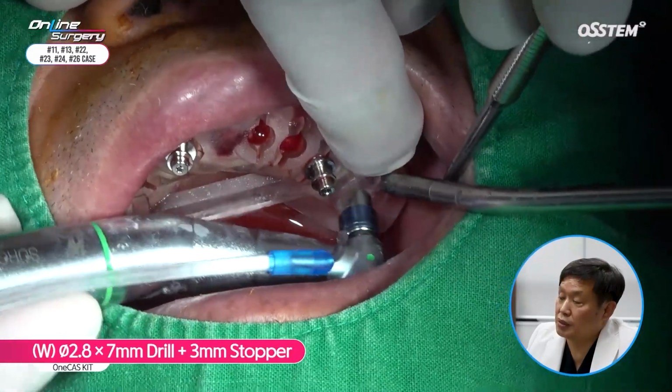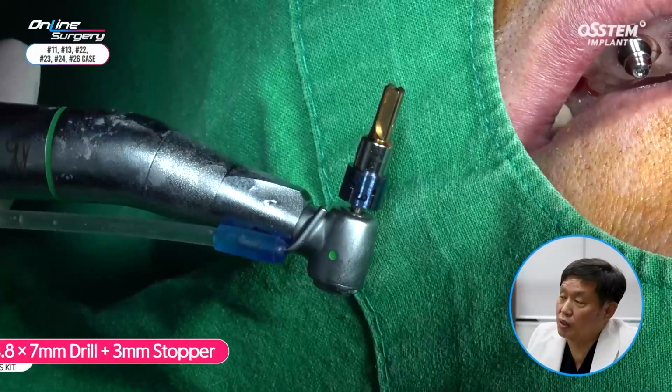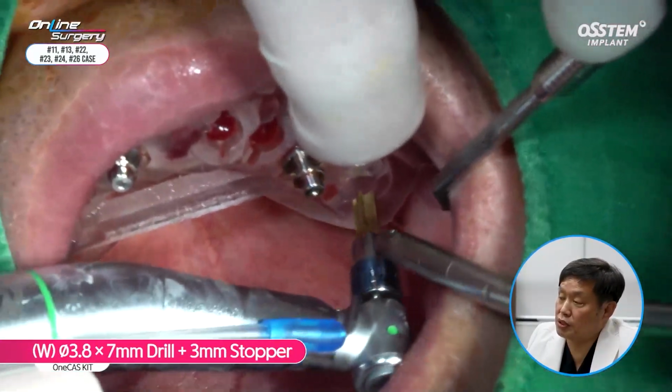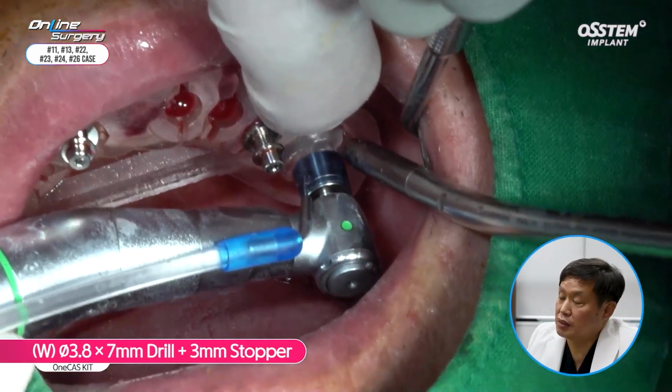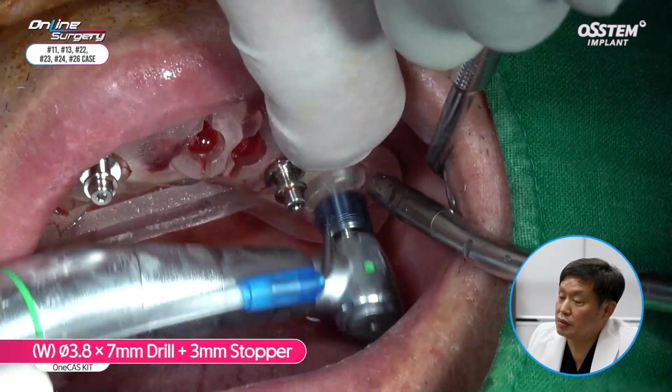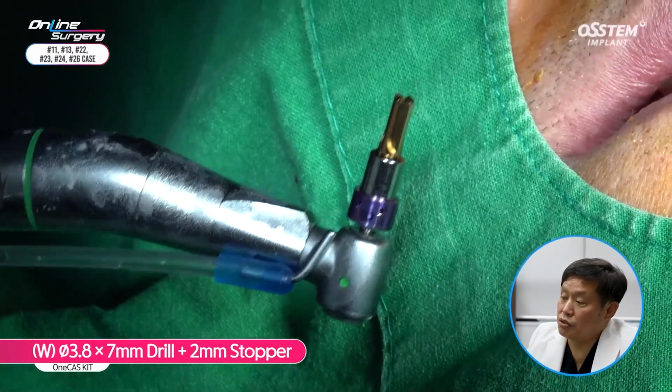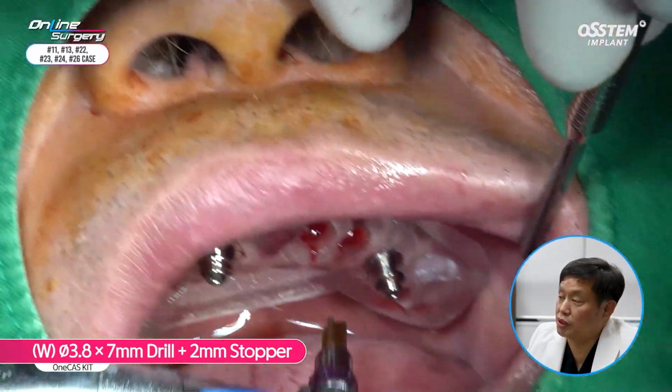2.8 with 3 millimeter stopper. For the final drill, a 3.8 by 7 millimeter drill with a 3 millimeter stopper. Drilling was done up to 4 millimeters. So we're going to move forward.